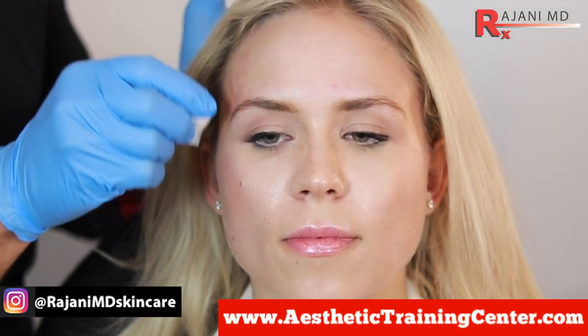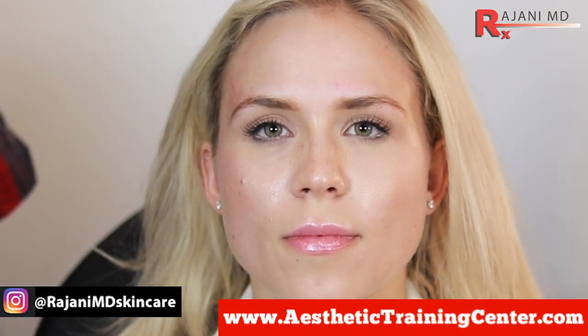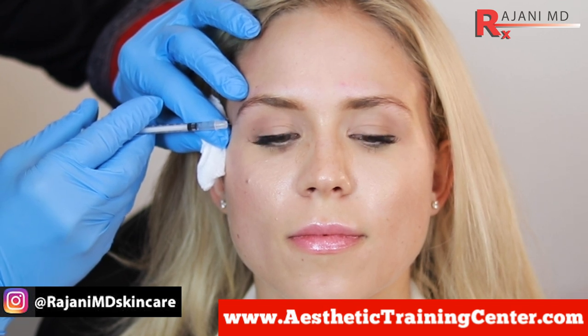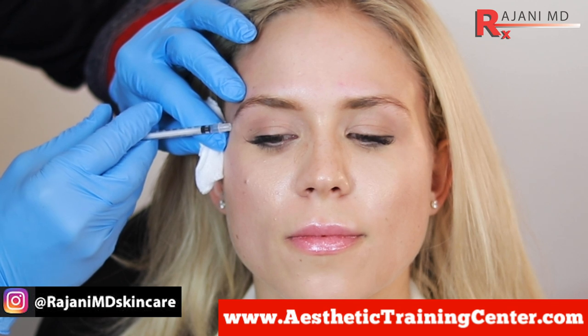If I want more volume, then I could add a twist, but today we're using smooth. She has pretty good volume. It's part of the brow lift. On the patient's right side, we add neuromodulator for the downward fibers of the orbicularis oculi — right at the tail of the brow — and we inject our product here.